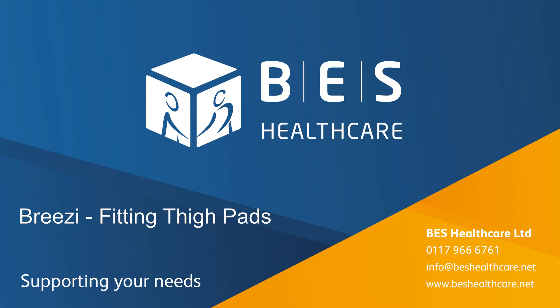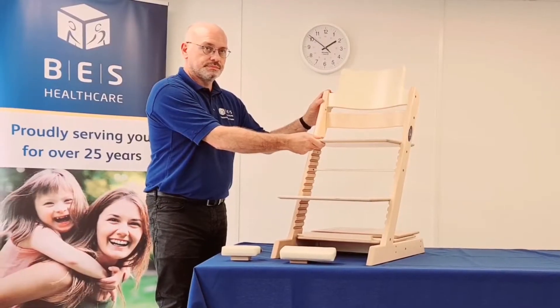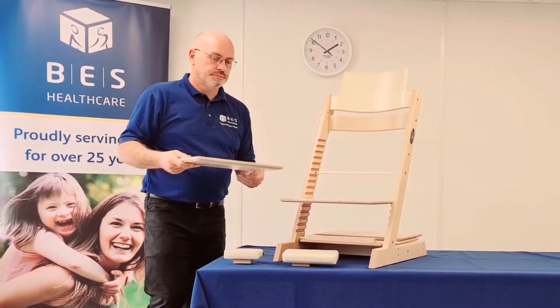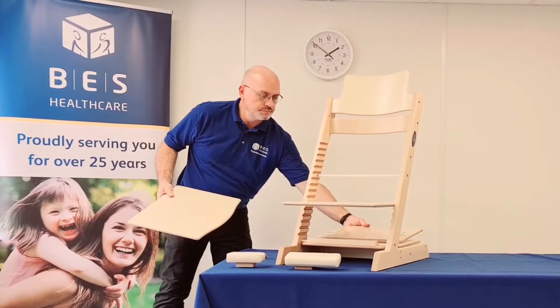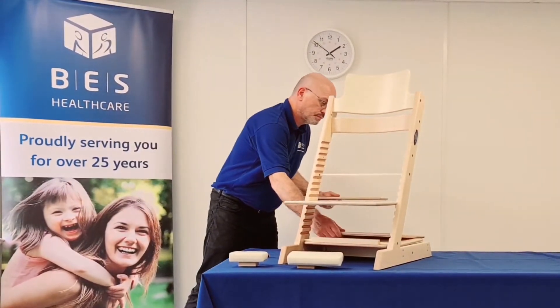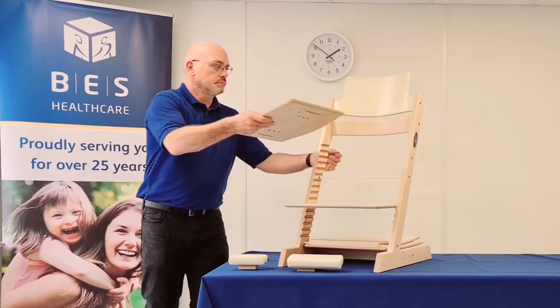Welcome to the instructions for fitting thigh pads to your Breezy chair. You will require a slotted seat plate to attach the thigh pads. If you do not have a slotted seat plate for your Breezy, please contact your local assistive technology specialist for more information. You can find the contact details on our website.